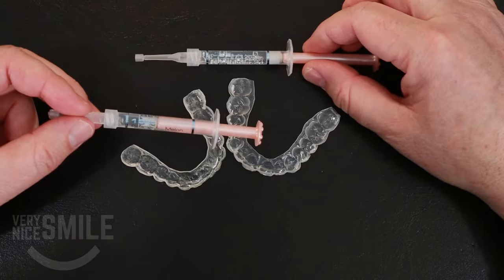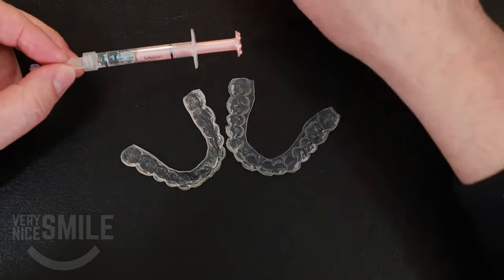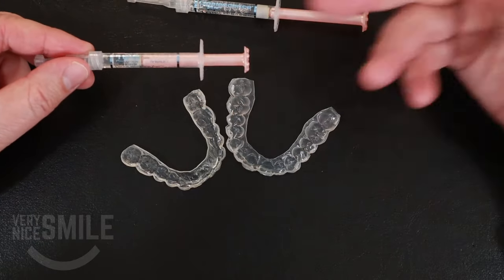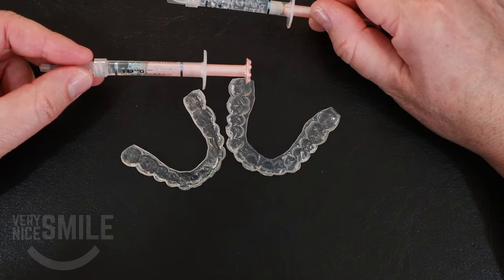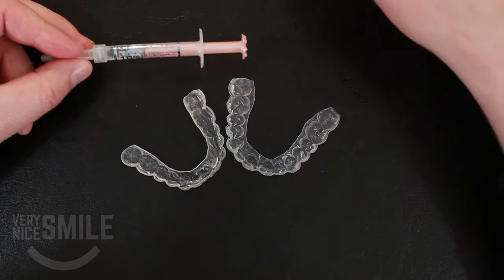I actually whiten my teeth with all the expired gel that I bring back from the office. The stuff that I buy to give to patients — if it expires before I can hand it all out, I bring it home and use it. And it works.